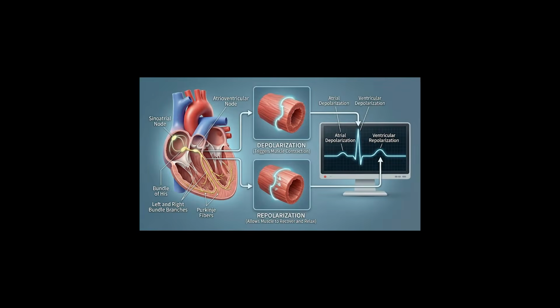Now that we understand the cameras, the leads, we must look at what they are recording: the current flow in the heart. This involves the heart's specialized conducting system and 2 primary electrical states: depolarization, which triggers muscle contraction, and repolarization, which allows the muscle to recover and relax.